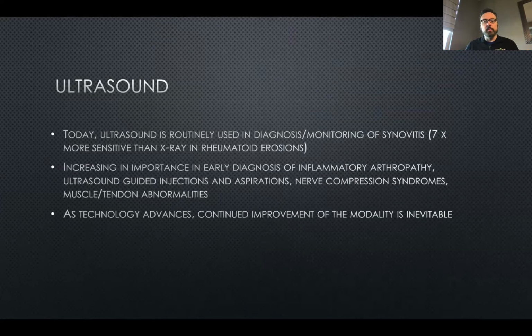Today, rheumatology is still using it a lot. It's routinely used in monitoring synovitis. It's actually 7 times more sensitive than X-ray if you're looking for subtle rheumatoid erosions. They're using it for guided injections or aspirations, inflammatory arthropathies, muscle and tendon abnormalities.